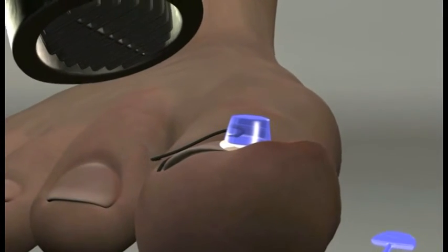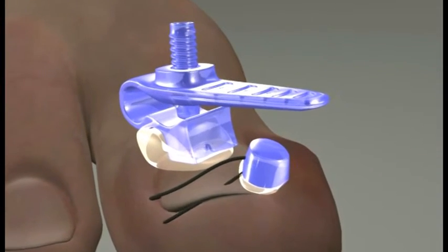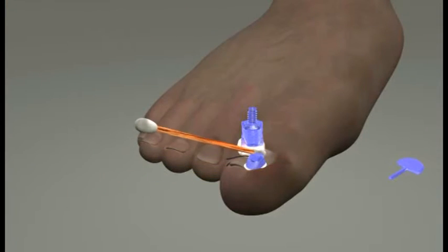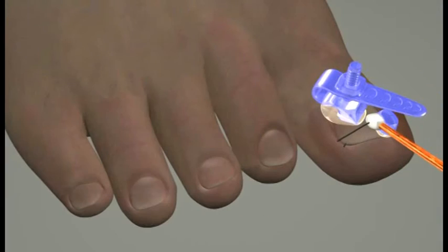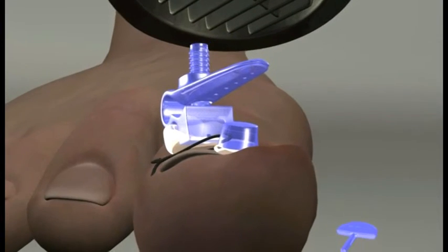Now we glue the crane to the opposite side of the nail and clean the excess glue with a cotton swab. We dry the glue with hot air again. It will take approximately 30 minutes for the glue to completely dry.